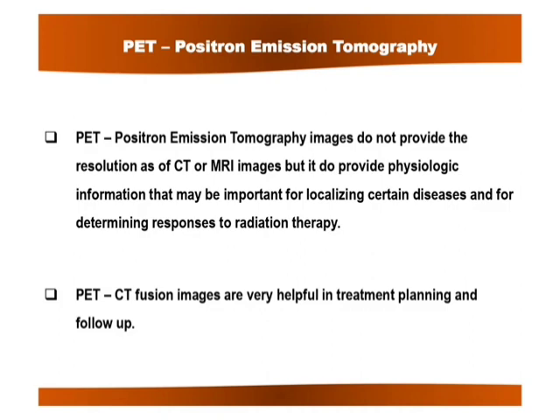So many linear accelerators are coming nowadays with an inbuilt ultrasonography system, so that you can delineate the tumor during the fraction and interfraction movement.